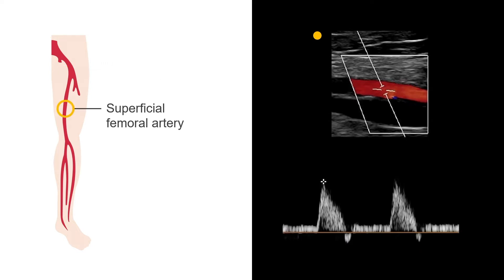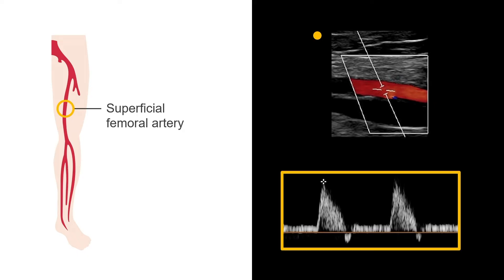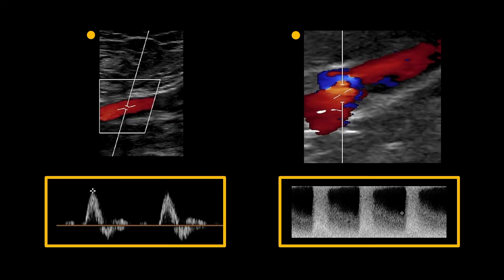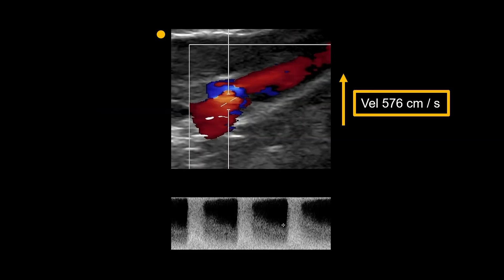Further down the leg, at the mid-superficial femoral artery, or SFA, the waveforms are still multiphasic, which indicates normal flow. However, at the popliteal artery, this waveform is produced. Compare the normal CFA triphasic waveform to this intra-stenosis popliteal waveform and notice a spectral broadening, which is snowy filling of the waveform window due to turbulence produced by the stenosis. Also notice the velocity increased to 576 cm per second, compared to 58 cm per second previously seen in the SFA.